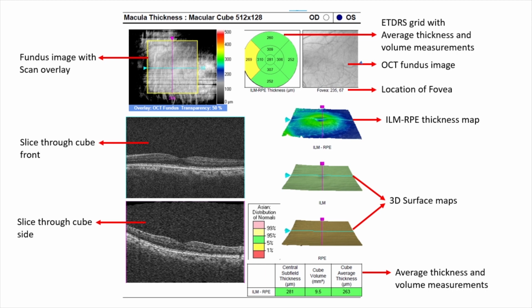Anyone? 6, usually 4. Correct me if I'm wrong, OCT team sitting here. On either side, plus minus. Yeah, it's usually 4 diopters plus minus that you would take to take your normative data. Okay. So not only race, you have gender, you have refractive error, and you have age.